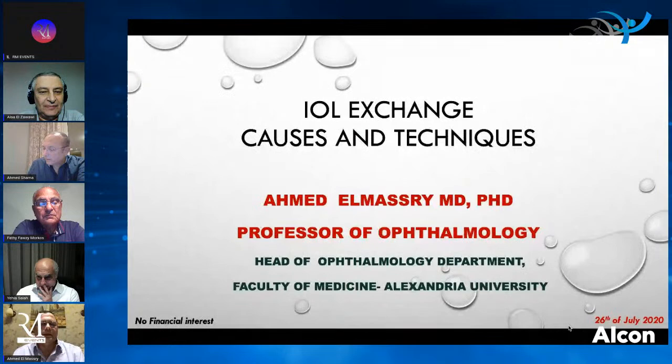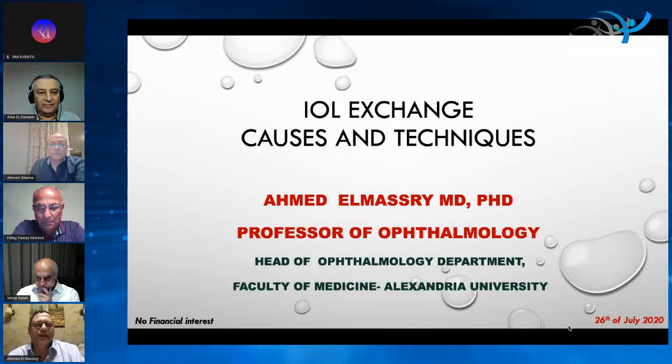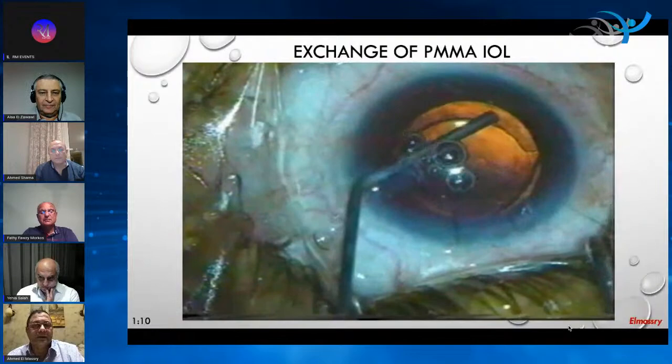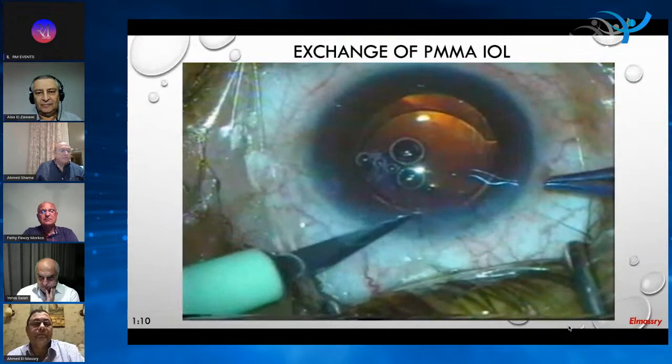Maybe this is a little bit different than the previous talks about phaco itself and the cataract, but we really face this problem many times, and I just want to discuss the causes and techniques of IOL exchange. Of course, the most common is the wrong power. This is an old case of extracapsular cataract extraction with a PMMA IOL, and it had the wrong power. After 2 months, she was referred to me for IOL exchange.